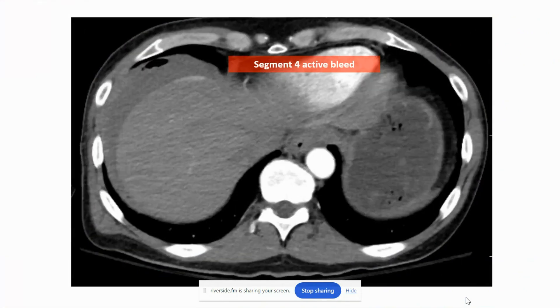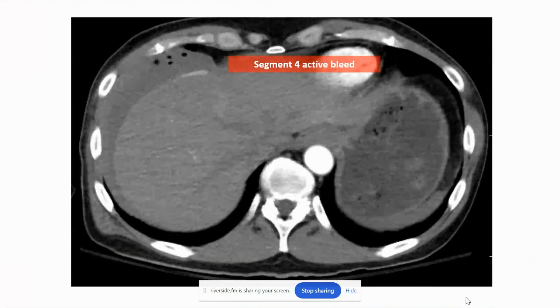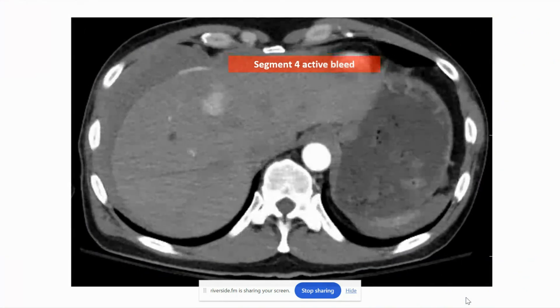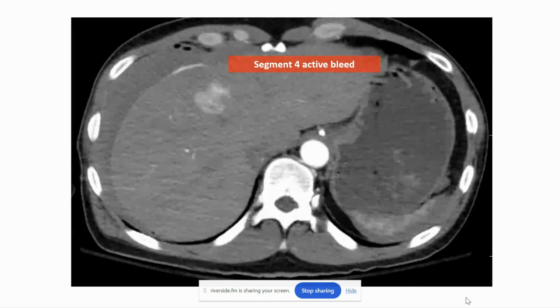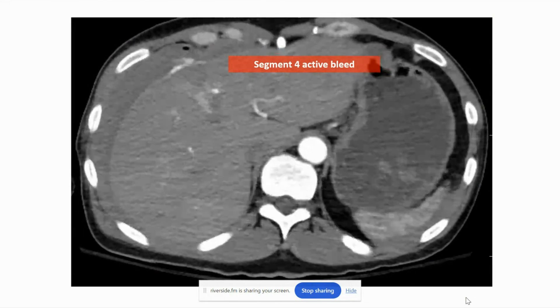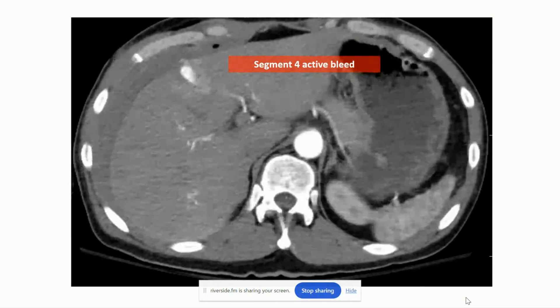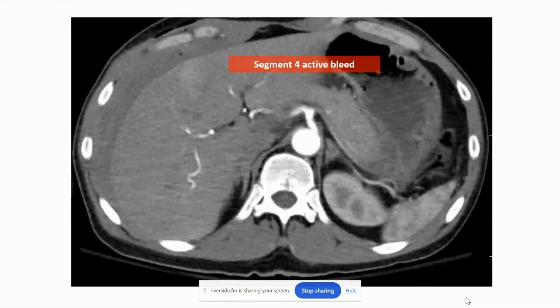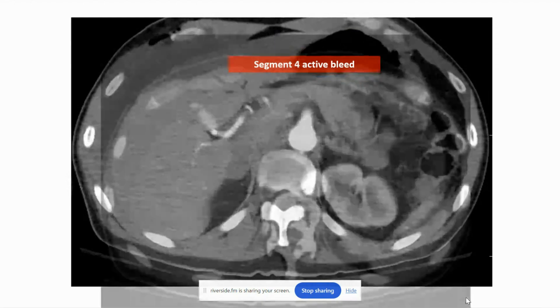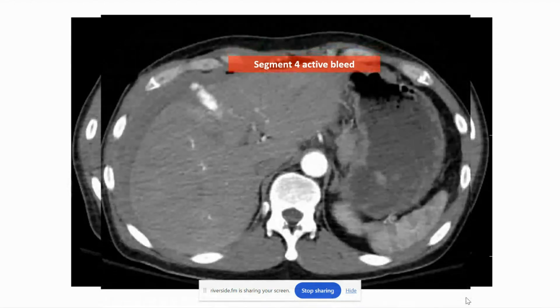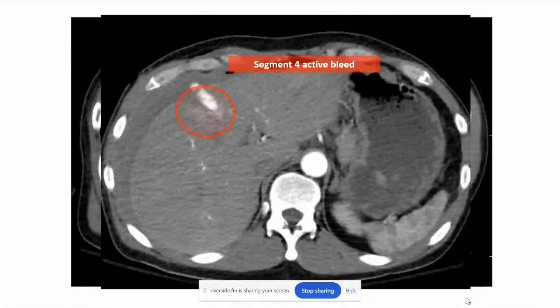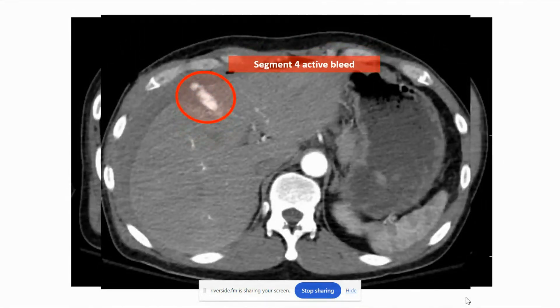And on this CTA, you can see as we scroll through it, there is a pretty large, obvious bleed here arising from Segment 4. And this is just a still image showing that bleed again.